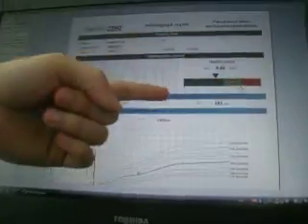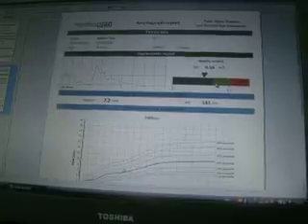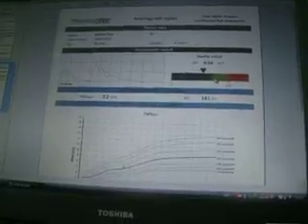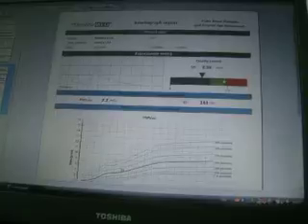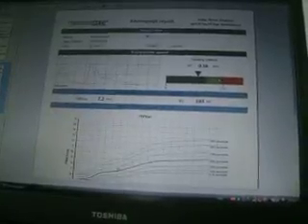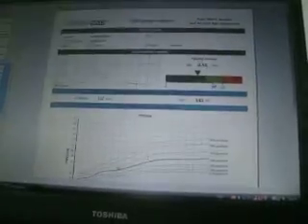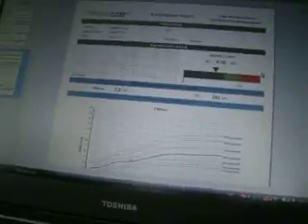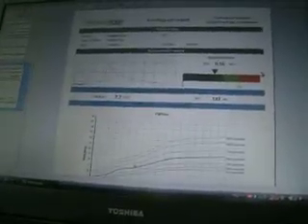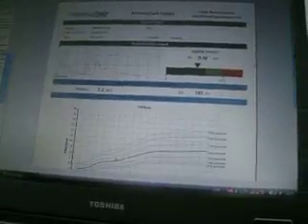This is a quality control index. It should be in the green area. The yellow area here would show you that next time you should be careful with that measurement, ensuring that there is no disturbance, no movement, and no anything that can affect the oscillometric measurement. If the quality control would be in the red field, it would automatically mean that you should repeat the measurement and reject the calculations from this measurement. Now we are in the green, so that's correct, that's perfect.